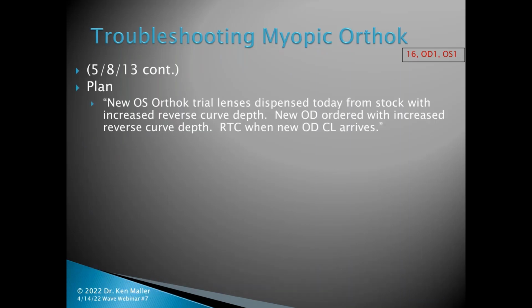And so the plan now was that the left Ortho-K lens was dispensed from the stock, but they found one with an increased reverse curve depth, and they apparently did not have a similar type of lens for the right, so they ordered a new right lens with an increased reverse curve depth, keeping the base curve and diameter the same. He was going to come in for that new right lens when that one arrived.